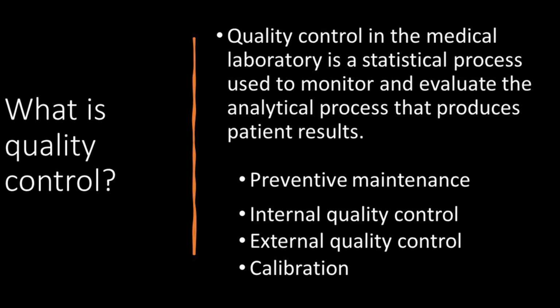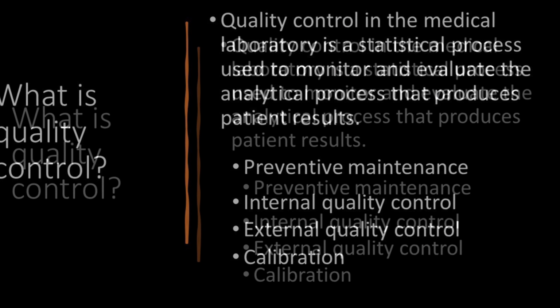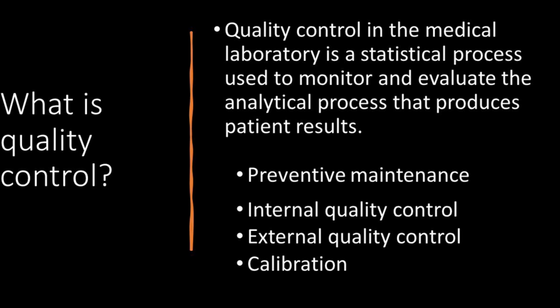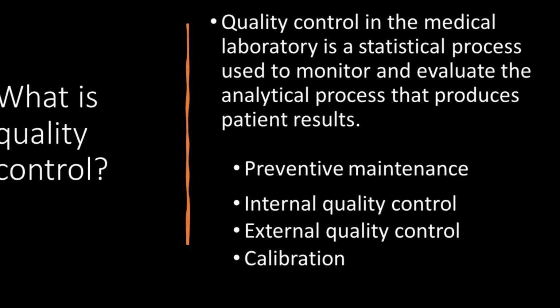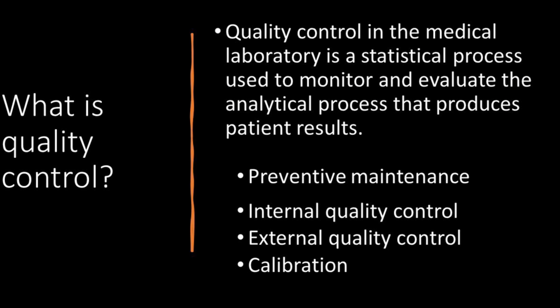Quality control in the medical laboratory is a statistical process used to monitor and evaluate the analytical process that produces the patient results. This includes preventive maintenance, internal quality control, external quality control, and calibration.